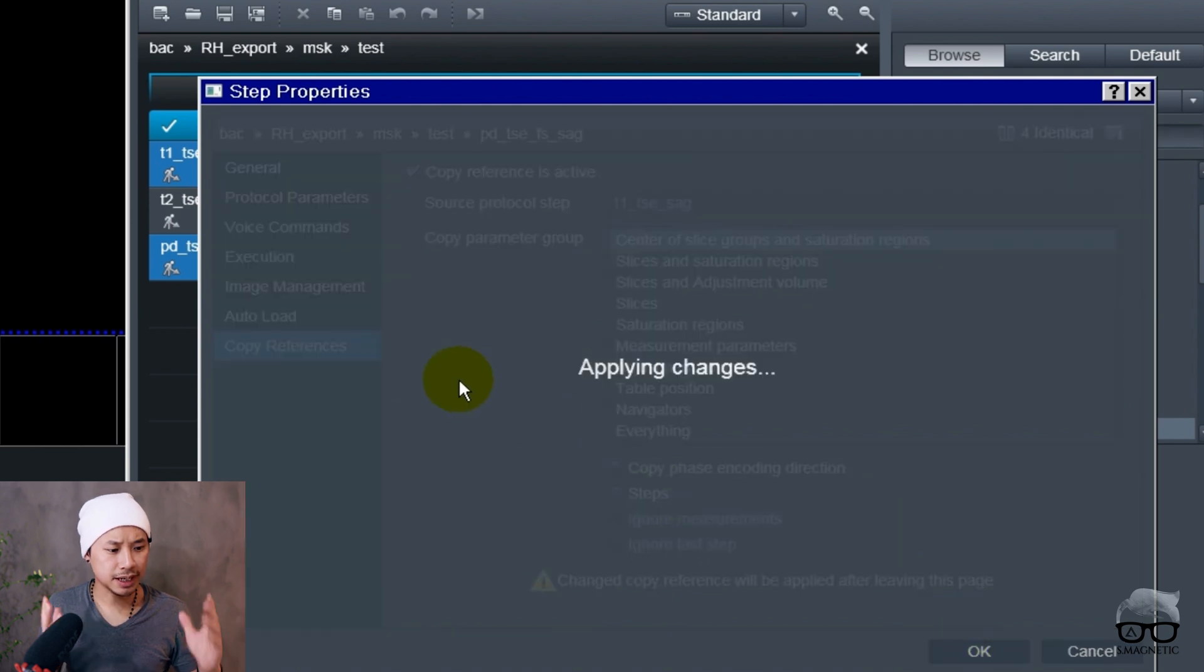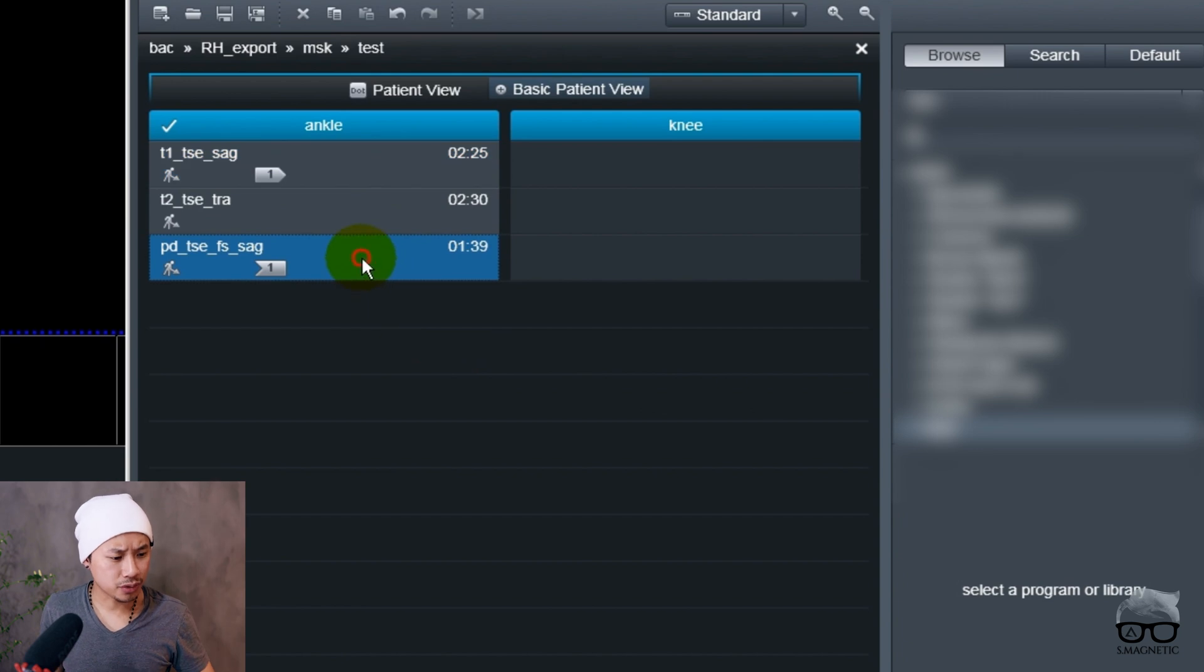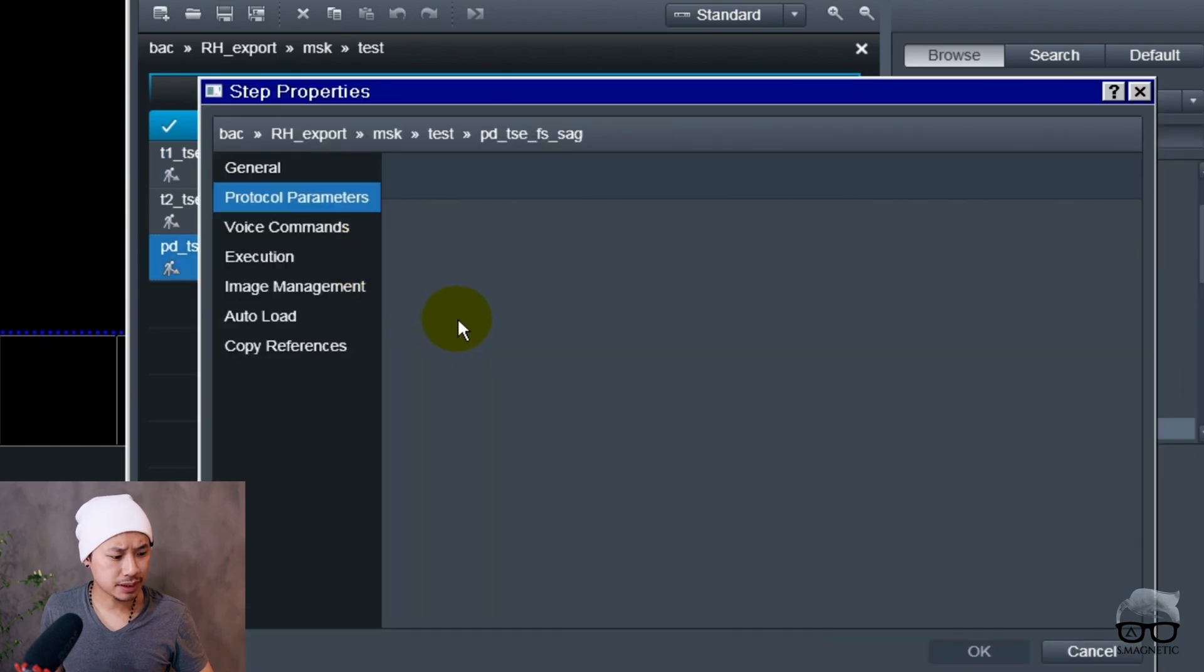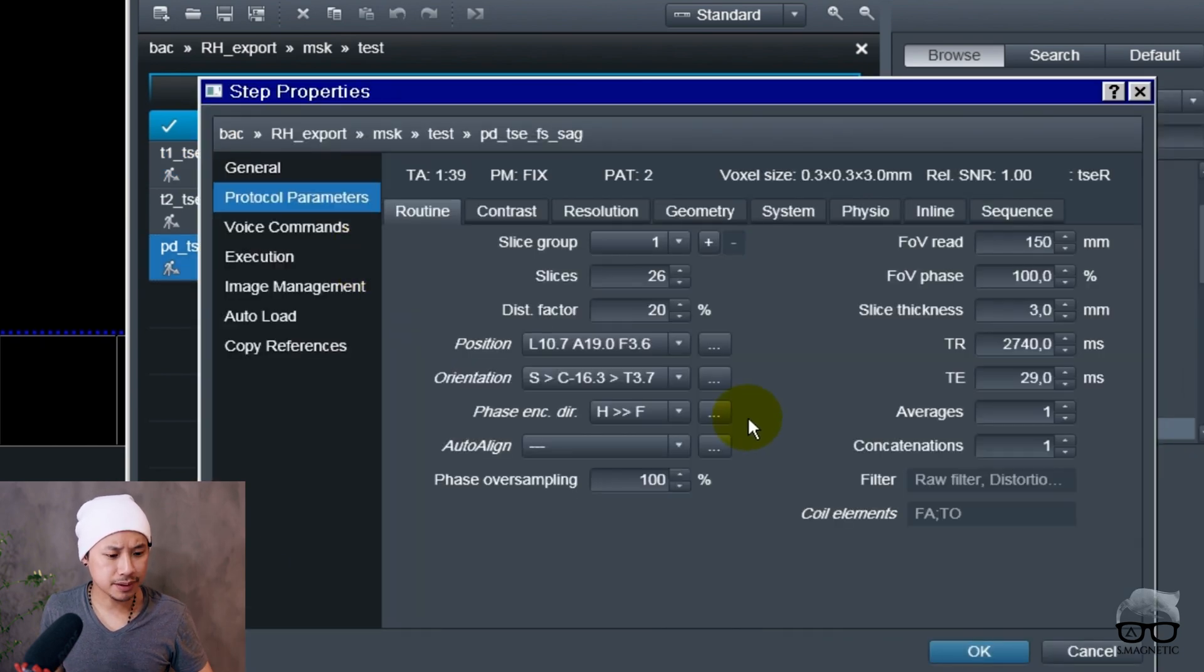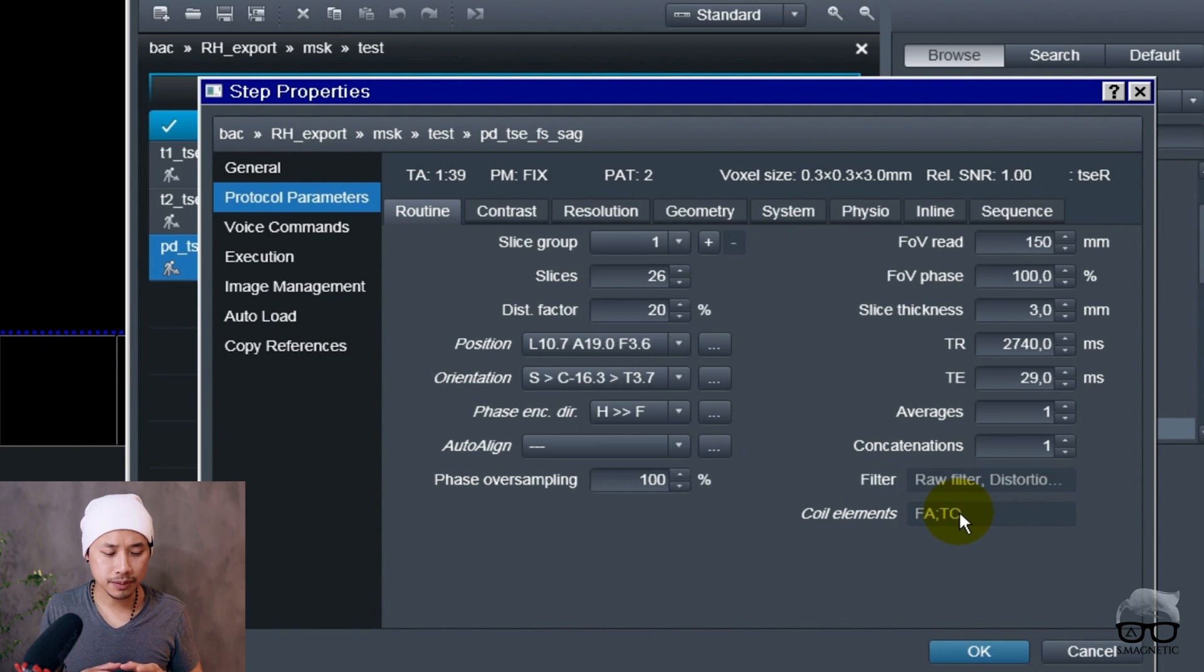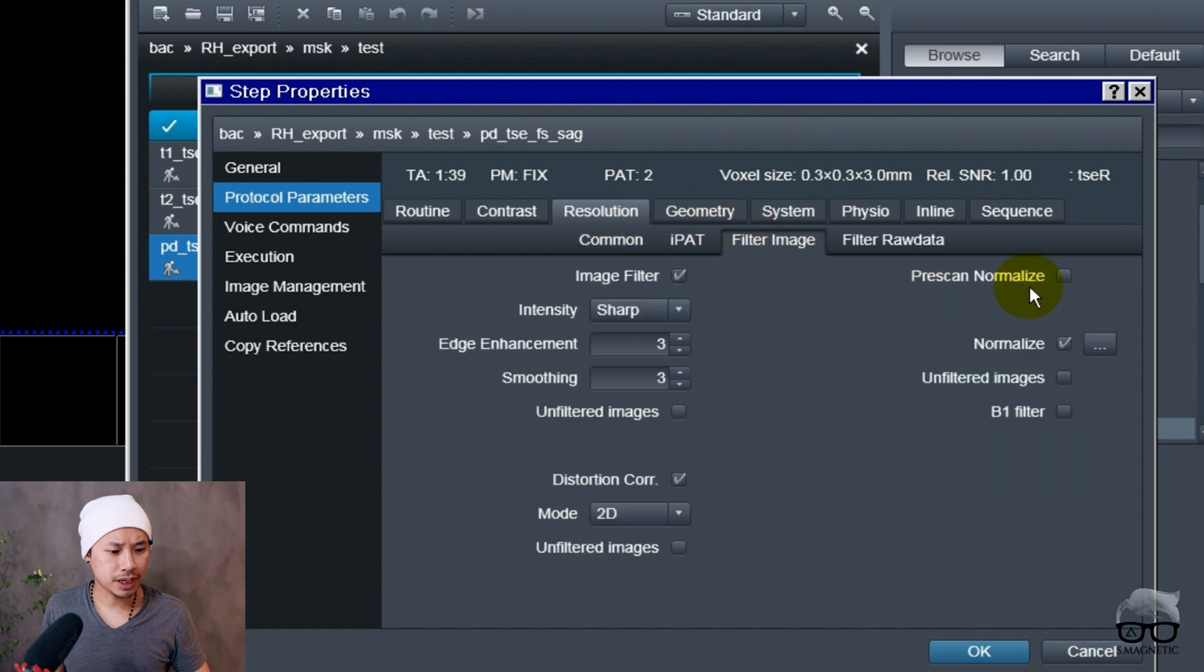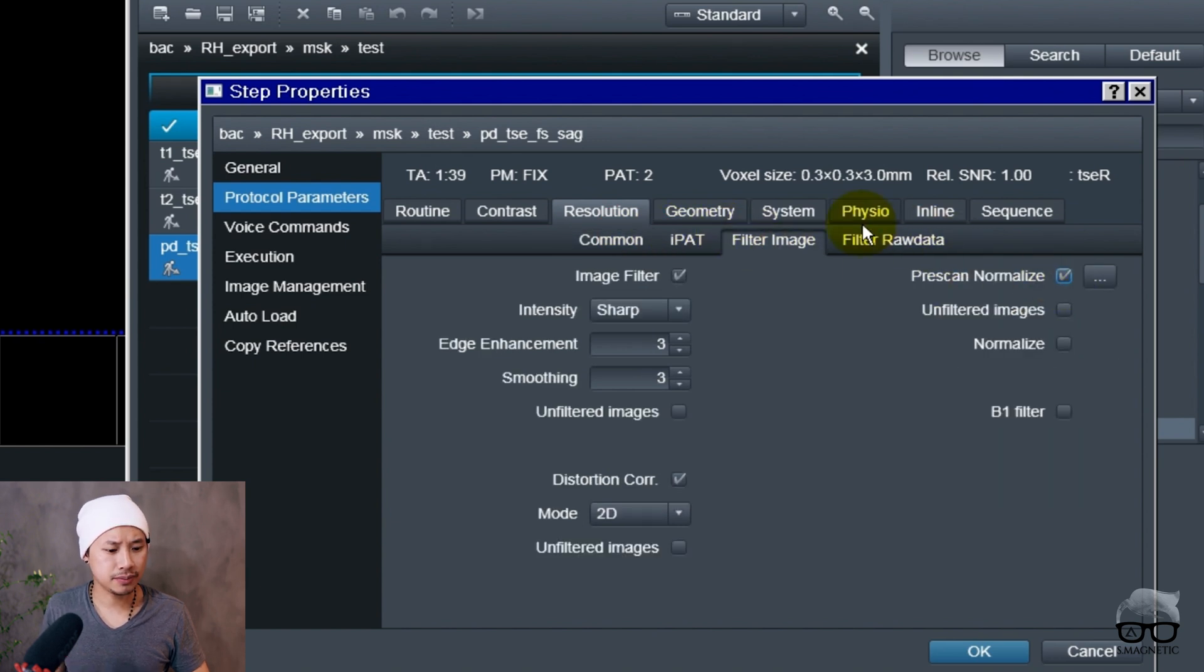Voila! What you're going to do now is open the sequence. You can see here it's now saved to the foot ankle coil, and all you've got to do now is put the pre-scan normalize on and save it.